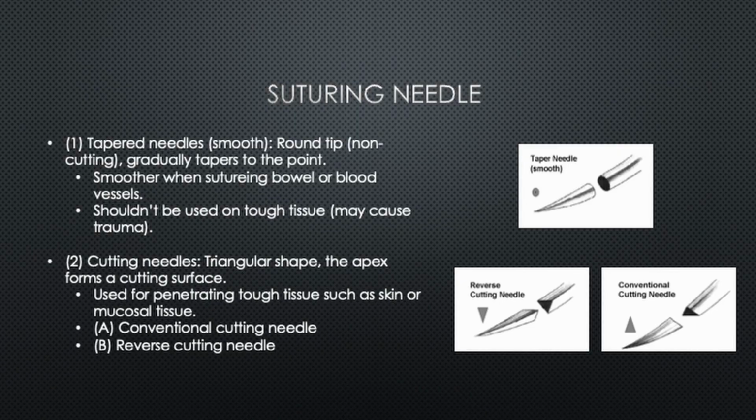Cutting needles, we have two different types, either conventional cutting edge or reverse cutting edge. They are triangular in shape. The apex forms a cutting surface used for penetrating tough tissue like skin or mucosal tissue.